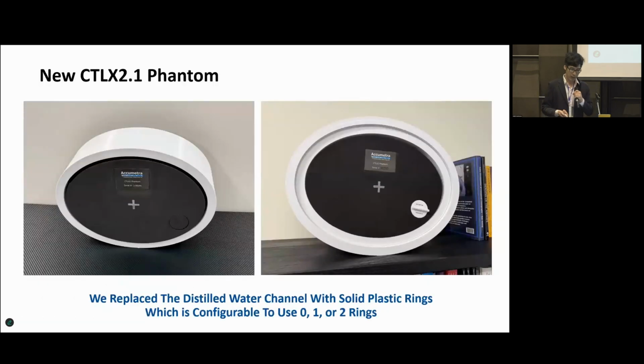What we had shown earlier was the version 1 of the phantom. He has this new version 2.1, which is a much bigger phantom. Inside, you have different objects of different density, and on the outside, you have these plastic rings, of which you can use a different number, and these are essentially there to help model the effects of different patient sizes.